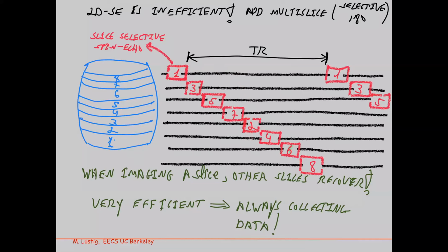Maybe, I don't know, if this is 50 milliseconds, let's say 50, 100, 150, 200 milliseconds. So it's a lot of time for it to recover. Maybe not recover fully, but it's good. You can put more slices, of course, and that makes it easier.